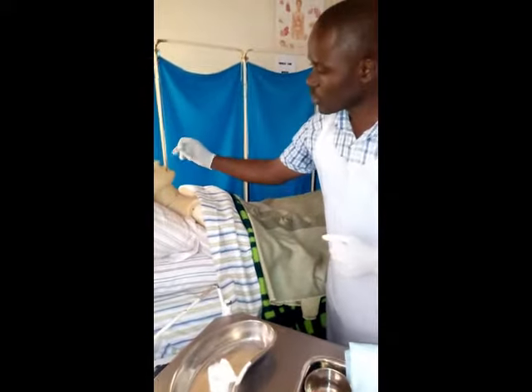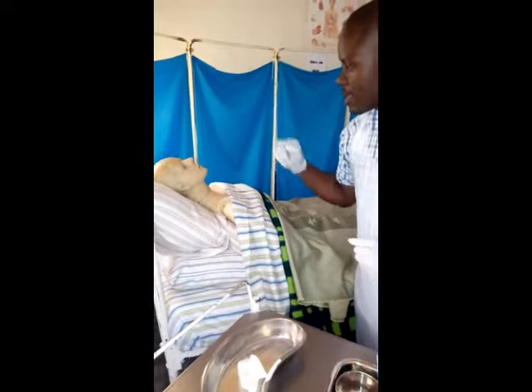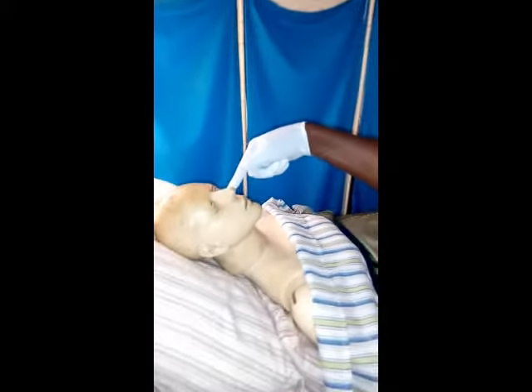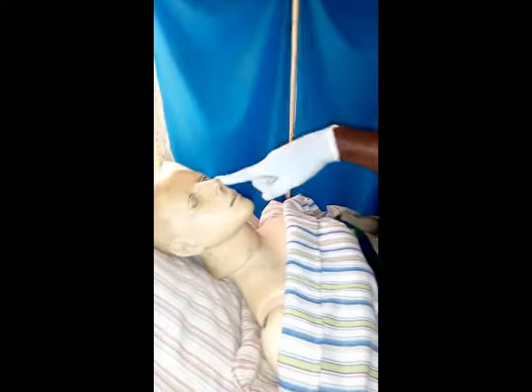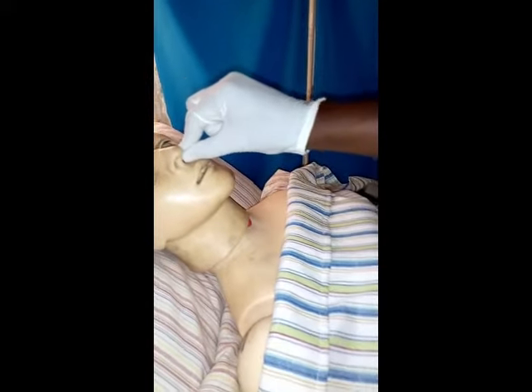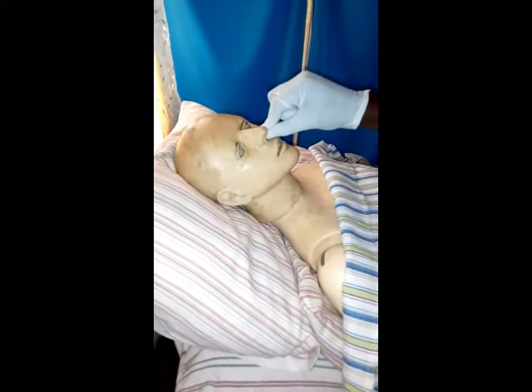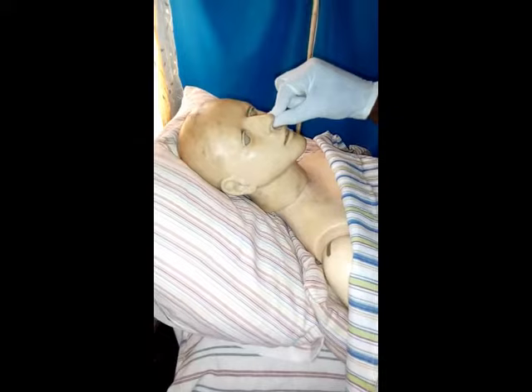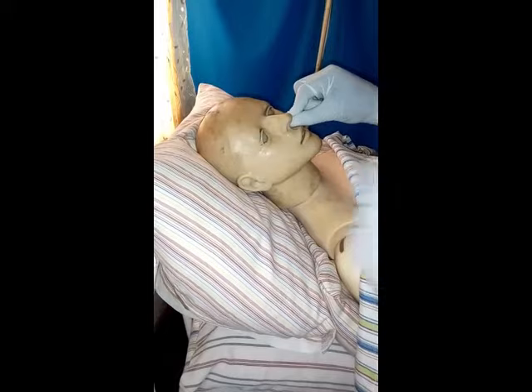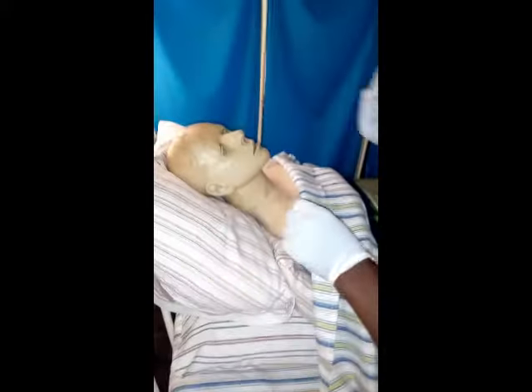So what we're going to do is we're going to occlude one nostril at a time. So one nostril at a time, meaning this nostril, this is the left nostril. So you need to occlude this. Okay? You occlude and then ask Mrs. Mwape to breathe. So Mrs. Mwape is breathing. Okay? Mrs. Mwape is breathing and she's comfortable. Meaning this nostril, the right nostril is okay, it's patent. So let's test now the left nostril to see if it's patent as well.